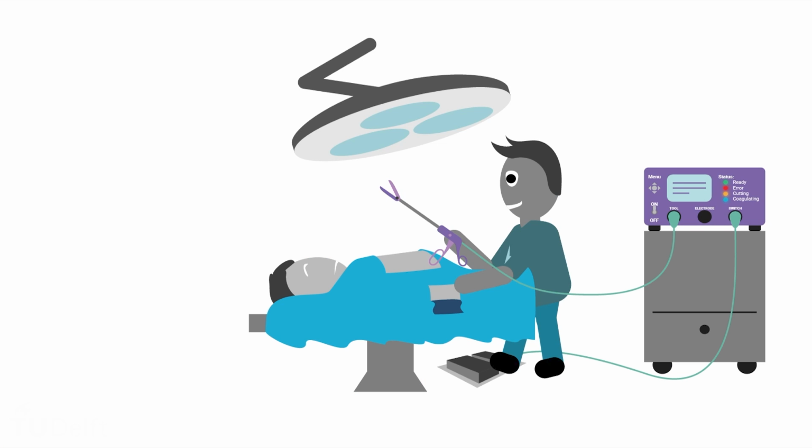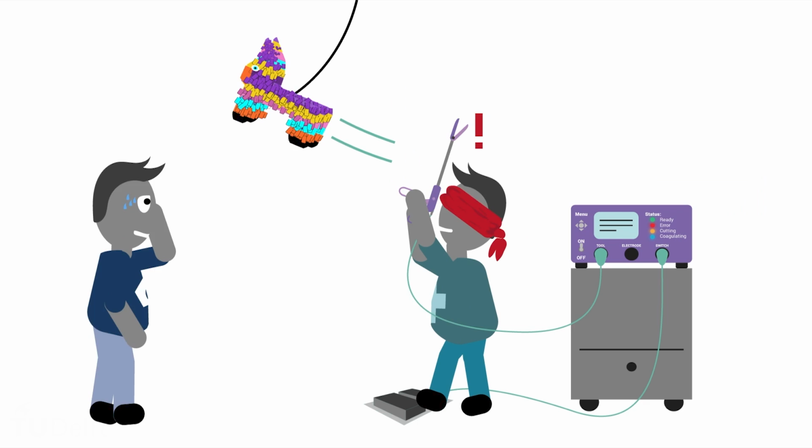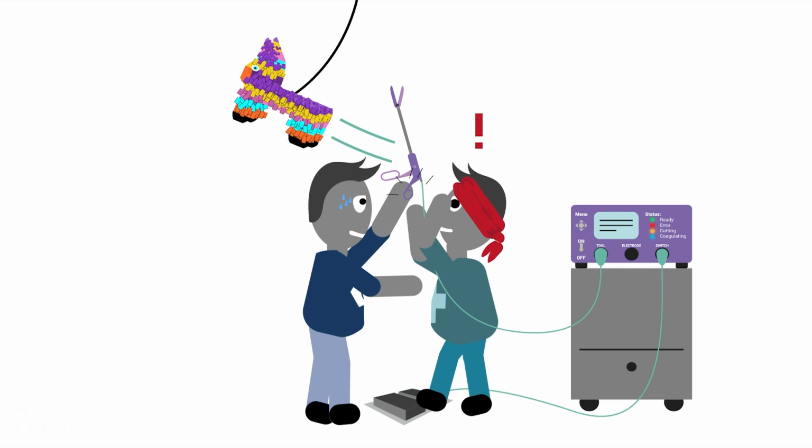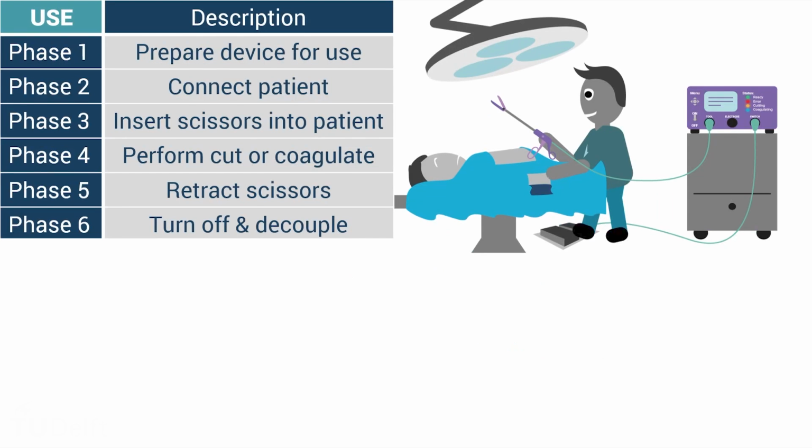Here we are, back at the operating room with our electrosurgical system. Because you, as the manufacturer of our electrosurgical system, also have the obligation to prevent any reasonably foreseeable misuse of our device, you need to inventory these misuses and their risks too.